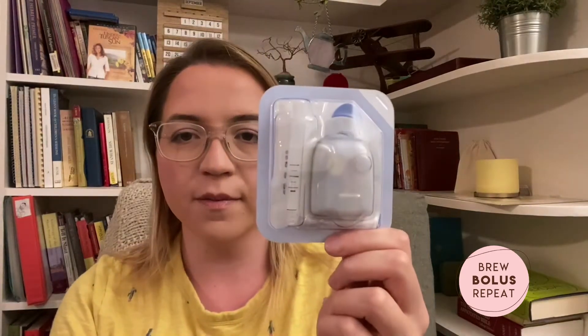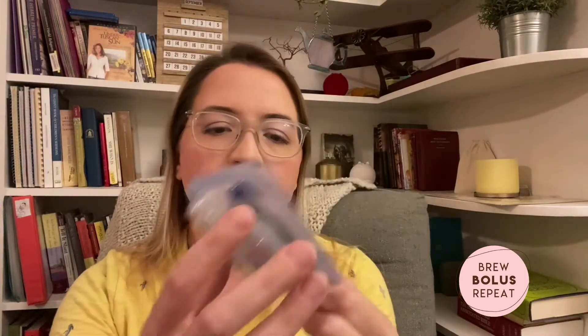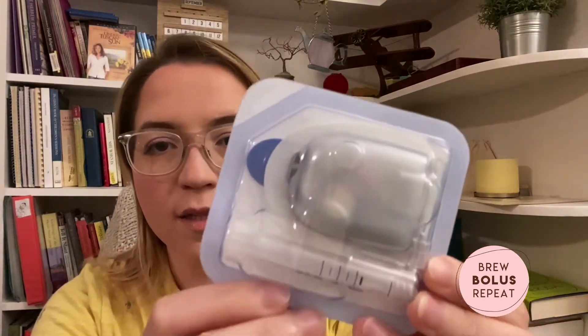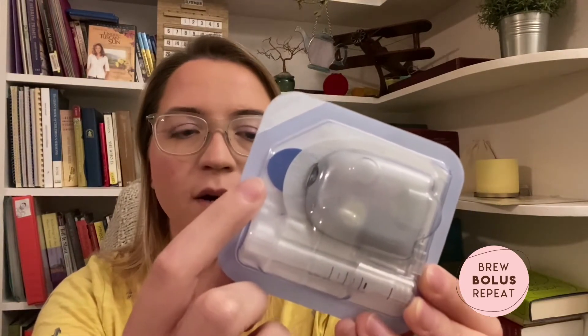Here is my pod. Each new pod comes in a little packet like this — just a plastic packet with some paper on the back. You can see the pod is in there. This one has a blue tab because this is the DASH system. Omnipod still has their Eros system — that's the older one. The pods are the same shape, but the difference is that these new DASH pods communicate via Bluetooth and the old ones communicate via radio waves, so they can't work interchangeably. You have to have the DASH pods for the DASH system and the Eros pods for the Eros system.